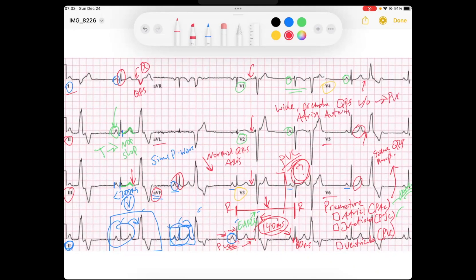So these are PVCs. There's one more thing I want to walk you through to make sure we categorize this EKG the right way. Notice that our pattern is: one normal beat, then a PVC, normal beat, PVC, normal beat, PVC, normal beat, PVC — in a repeating pattern.